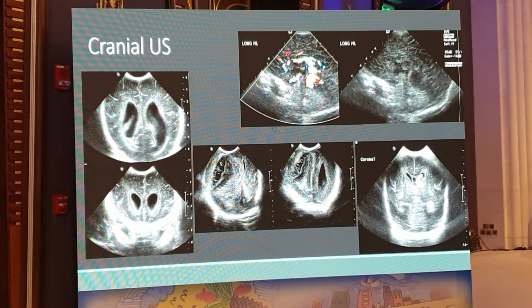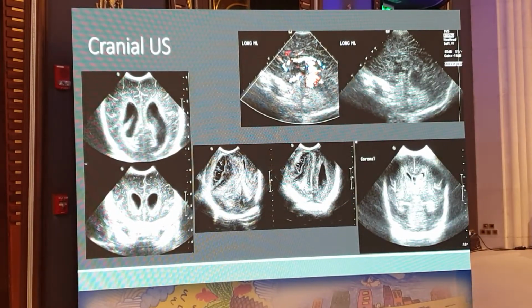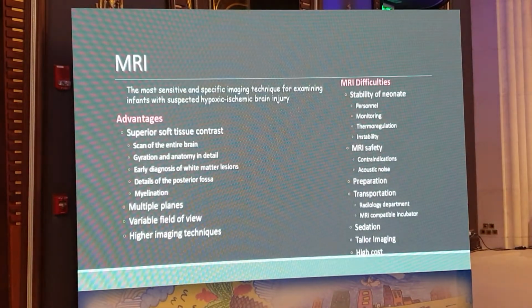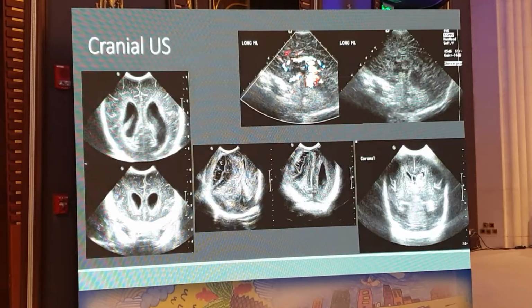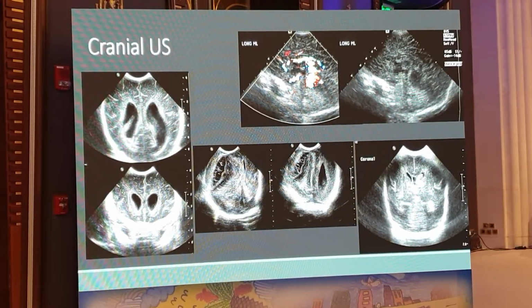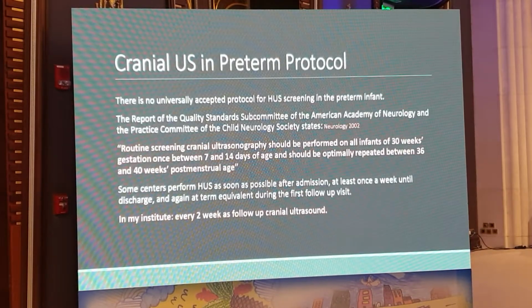So those are some ultrasound images. We can see that hydrocephalus is easy to be detected by ultrasound. So I don't know if it's working with the. Okay.